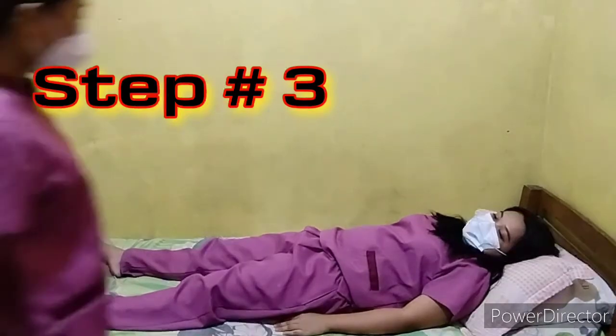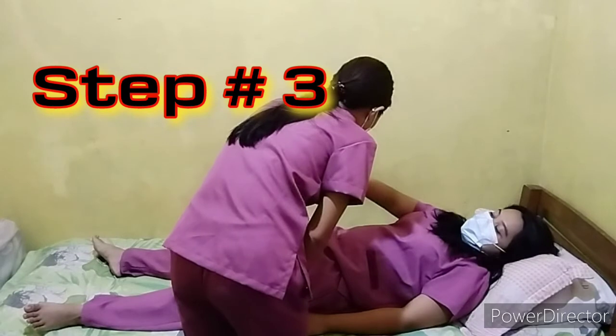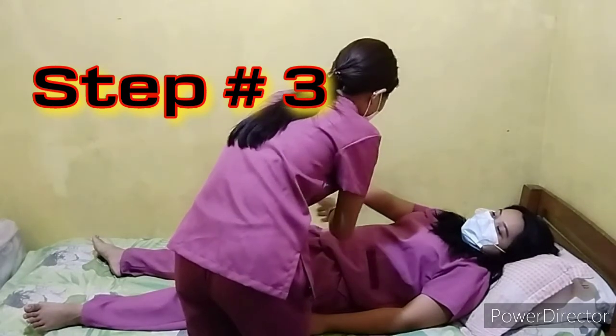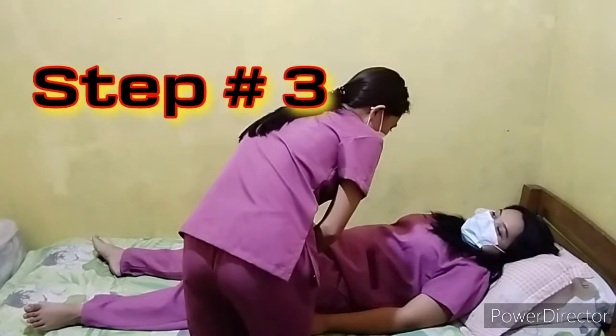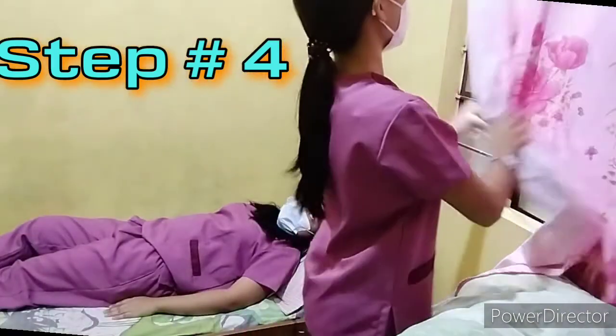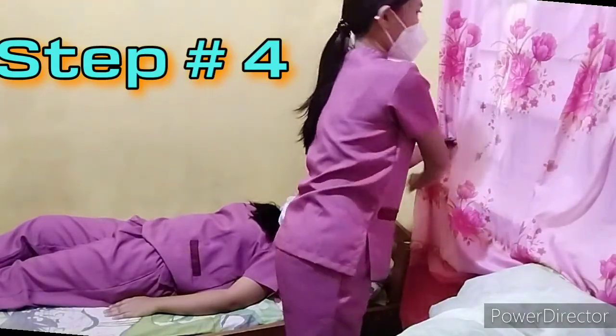In step number 3, identify the patient by checking the name and identification on the patient's identification band, or ask the patient to state his or her name. Identifying the patient helps prevent errors. And for step number 4, screen the patient to provide privacy.